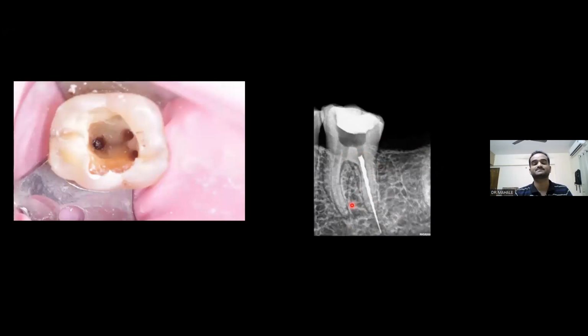Yes, they're learning. So this time, since I knew the trick, a long file, a NiTi file in the wide canal and tightly bound in the apical third, loose in the coronal third. I knew the trick. This time I had all the opportunity to make things right. This time I did not use any ultrasonic. I used only a GG drill to enlarge the orifice around this file, and then I directly went in with my two wires.